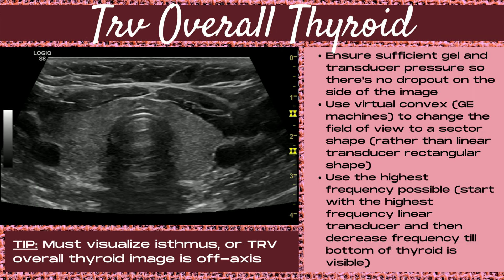When imaging the transverse overall thyroid, ensure that you have sufficient gel and transducer pressure so there's no dropout on the sides of the image. Use a tool called virtual convex — this is the name on GE machines — or any tool that changes the field of view from rectangular to a sector shape. This allows you to image the entire thyroid and a rim of surrounding tissue. Start with the highest frequency linear transducer and slightly decrease the frequency until the bottom of the thyroid is visible. Pro tip: you must visualize the isthmus, or your transverse overall thyroid image is off axis.